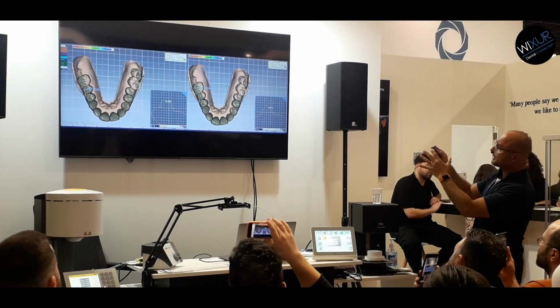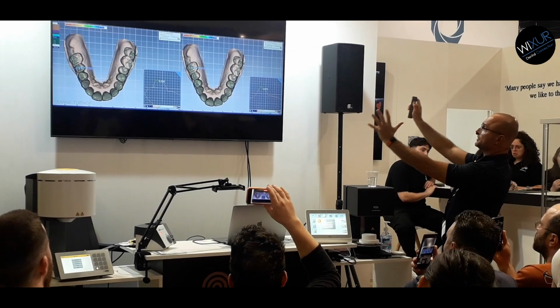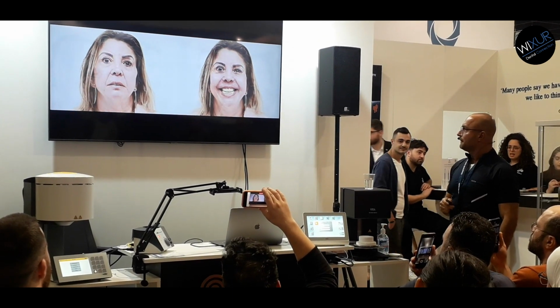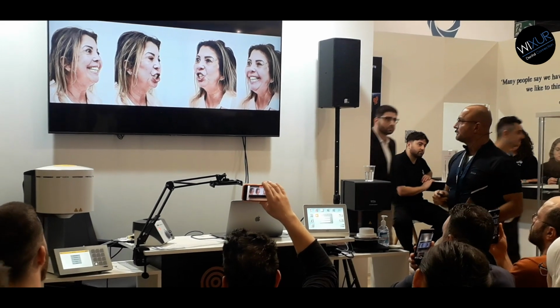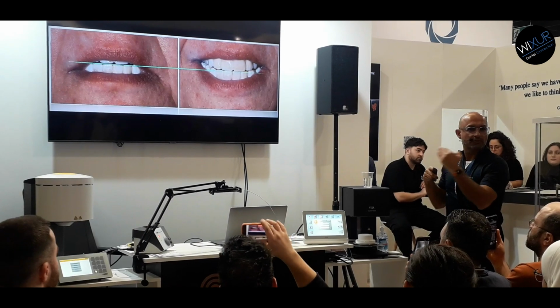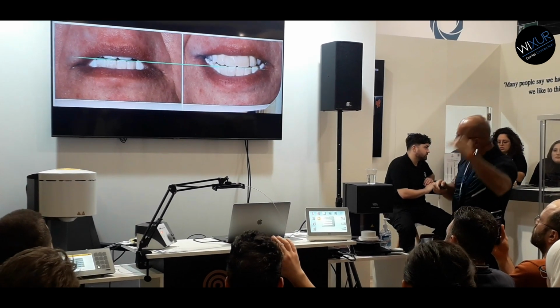So we are going now restoratively to expand the upper jaw, give more space. She sent me some videos because the patient didn't come every time to me. We see a lot of lower incisors, so we need to shorten them.